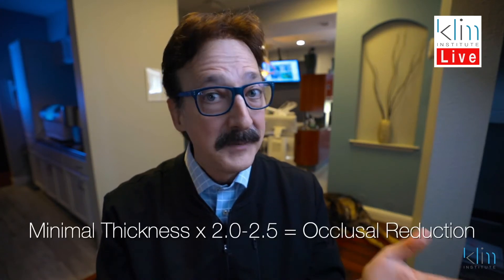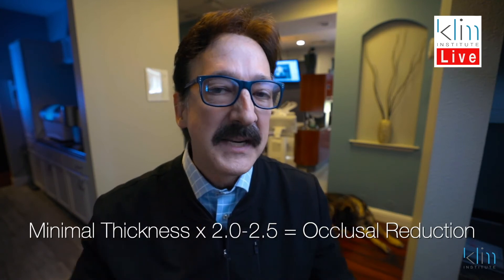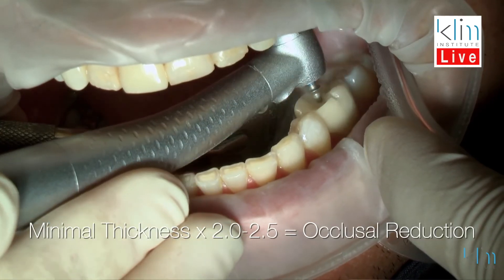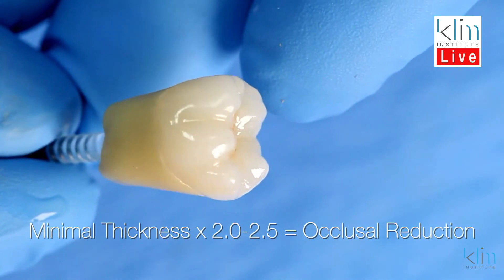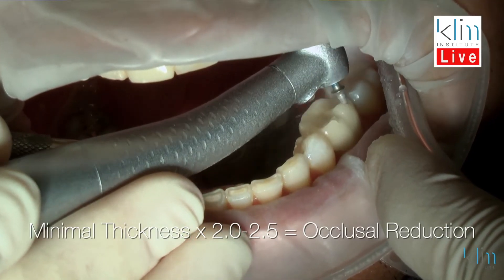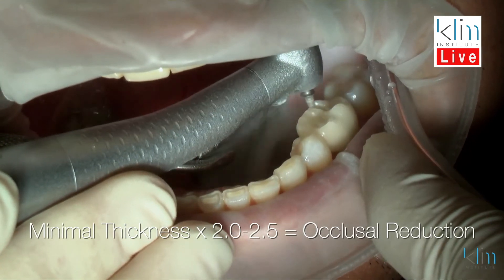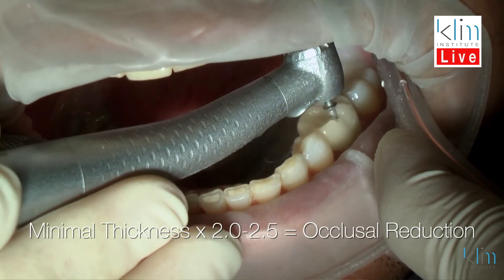You'll see this formula: it's minimal thickness recommendations by the manufacturer times two to two and a half. It may seem like a lot of reduction, but it's really not. Quite often when we're reducing, we reduce for the final morphology — it may not be the condition of that existing tooth if it's already flat and doesn't fit the morphological flow of the curve of Spee and Wilson for that arch. I spend as much time on my occlusal reduction as I do on any other surface, and we strategically shape it similar to the flow of the occlusal table we want for that final restoration.